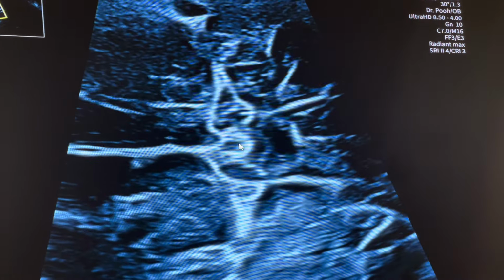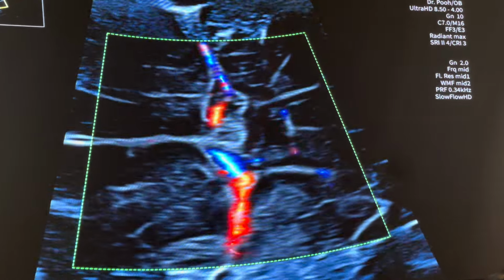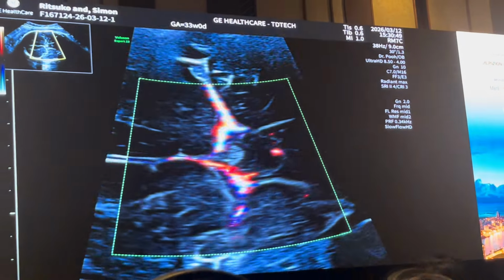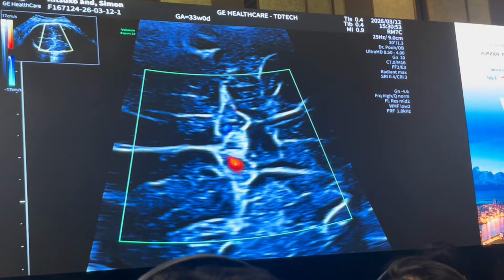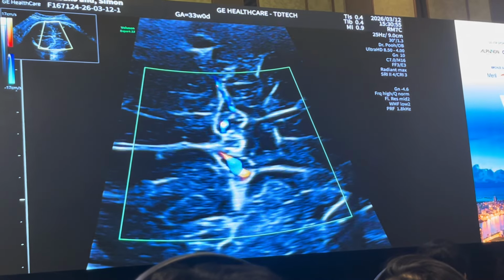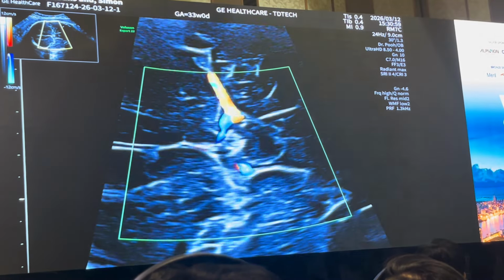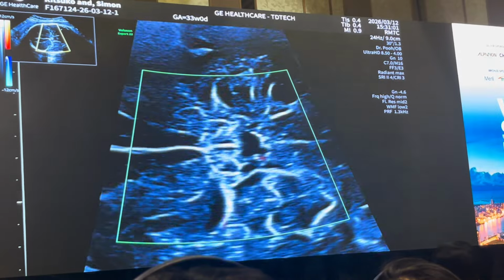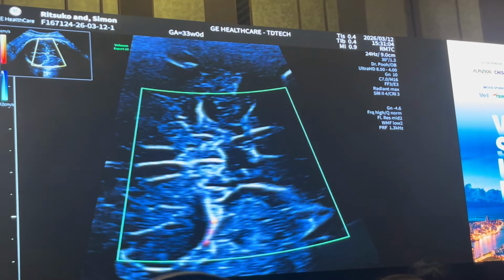And to show this, I will put on Doppler, and I will use color Doppler evaluation. And as I look with color Doppler, I have a number of choices. I can start with straightforward color, and if I use straightforward color, I reduce my PRF to 12 centimeters a second, because I want to see the communicating arteries and the full circle of Willis.